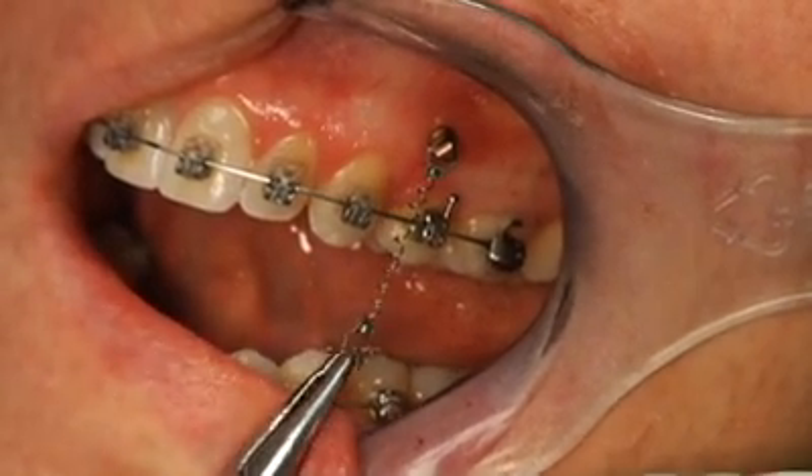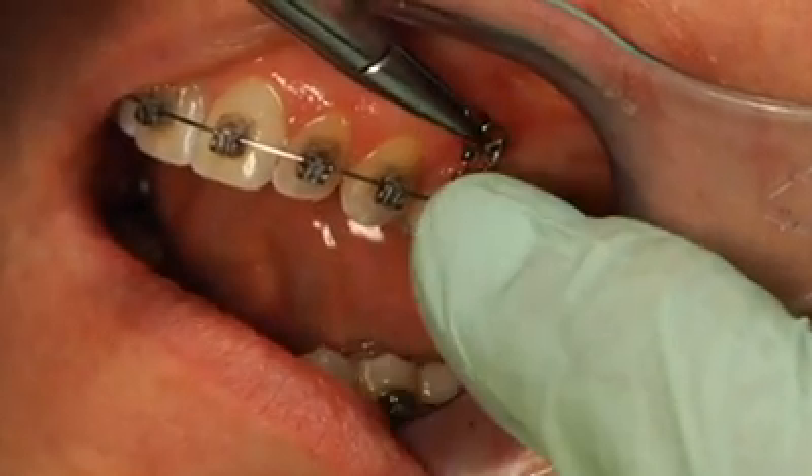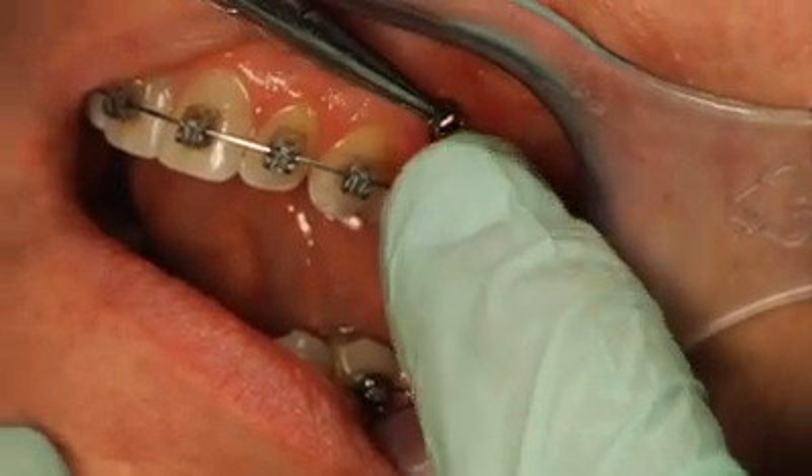This case requires one 150-gram double delta niti coil spring. Hook one end of the spring to the head of the mini-screw, thread the spring down and around the arch wire, and then attach the second delta loop to the mini-screw head.